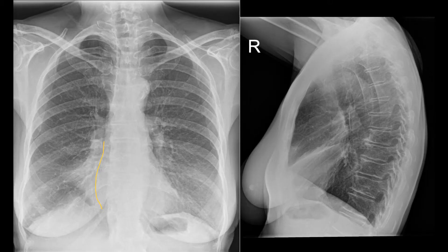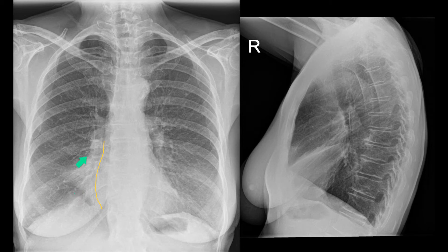This is where the right heart border should be, and the collapse is almost triangular, presumably because of the angle at which the x-ray hits the interface — it's almost tangential in places. Otherwise, you just get this hazy, increased density, which makes the right heart border invisible.